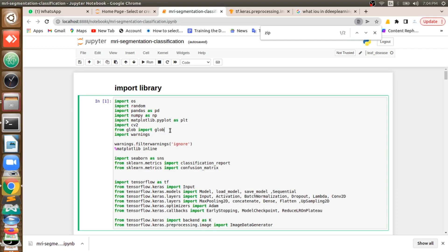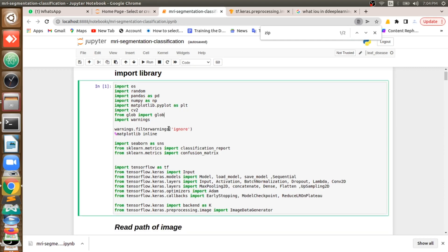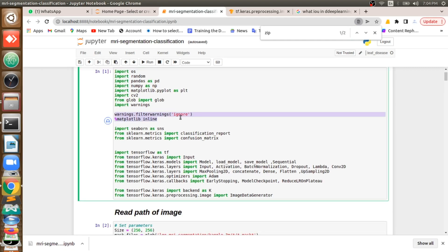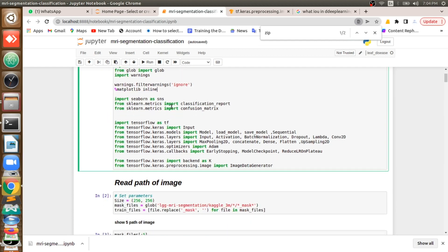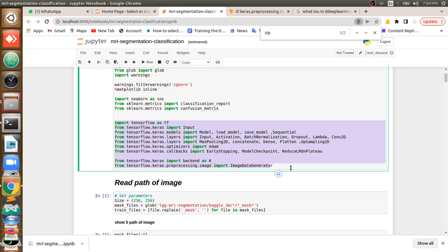We are suppressing warnings here so we don't get confused. We are importing seaborn, which is used to plot good visual graphs, and matplotlib. Then from scikit-learn we are taking classification report and confusion matrix — we will see how we use those at the end while building the model. The next libraries are TensorFlow and Keras, and we are using various sub-functions from them for our purposes.